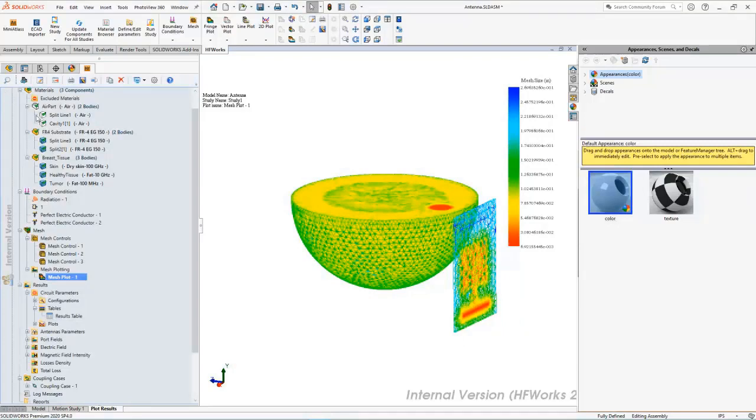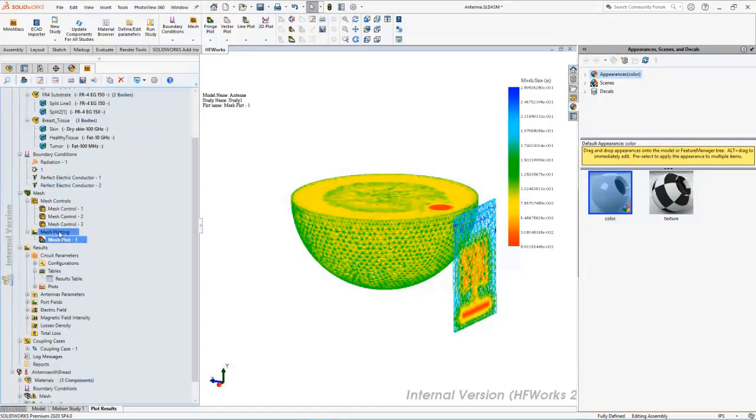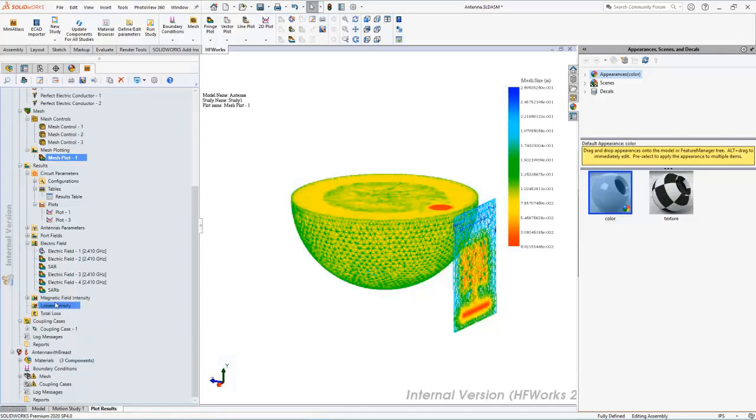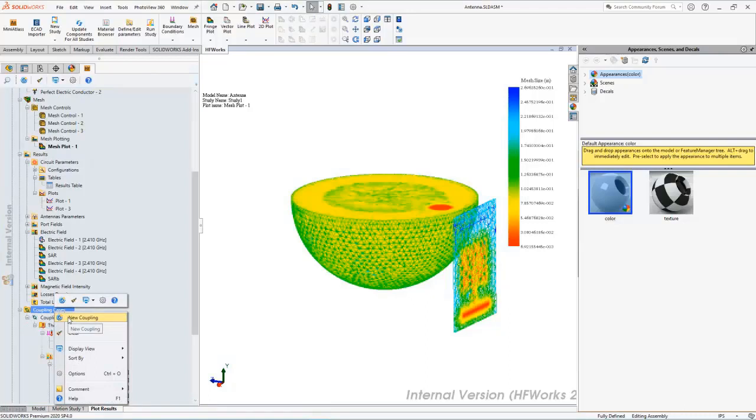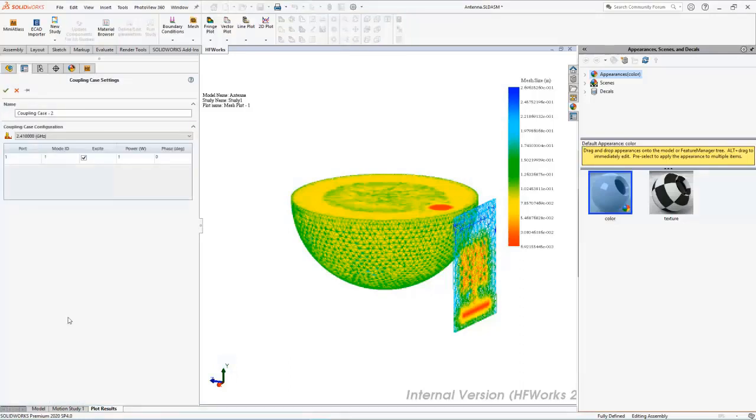After running the study, you can check your results, electric field intensities and magnetic field, and also S-parameter plots. Then you can add a coupling case. HFWorks allows you to perform coupled multiphysics simulations. It offers you a coherent environment where you can simultaneously study the electrical and thermal behavior of your high frequency design, right on the same model, with one single finite element mesh.